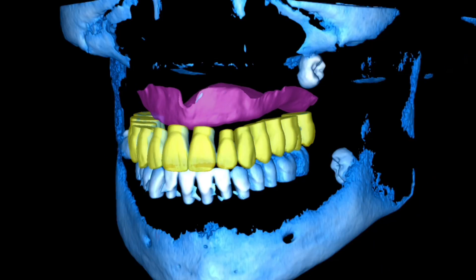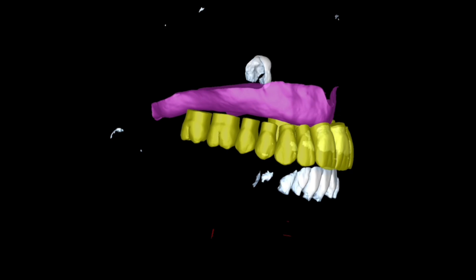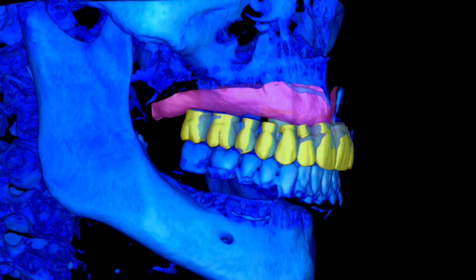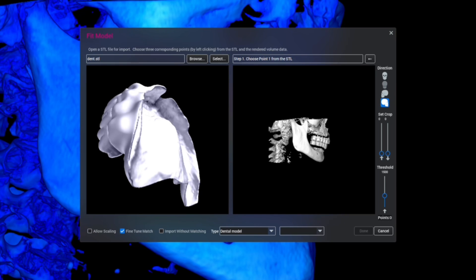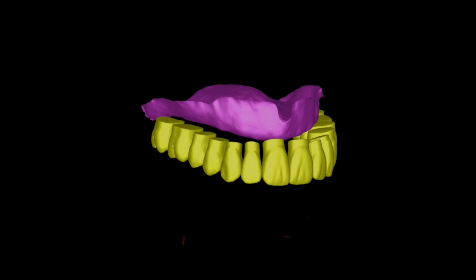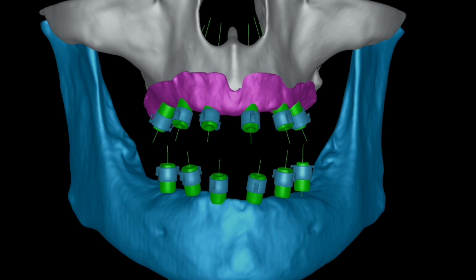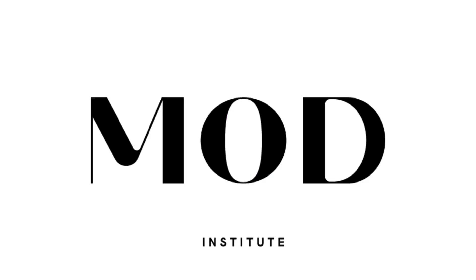In addition, you can bring in all your other digital design scans using the memory found within the intrinsic STL file, such as the soft tissue scan, and even the complete denture scan as well, as I'm doing here — without having to further pin anything, because of the way files are exported from ExoCAD and other design softwares. This of course leads to more accurate soft tissue guides and better bone reduction guides, and the whole entire planning is going to be much better.